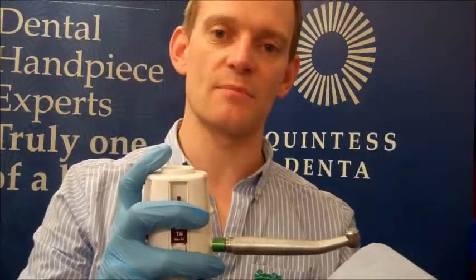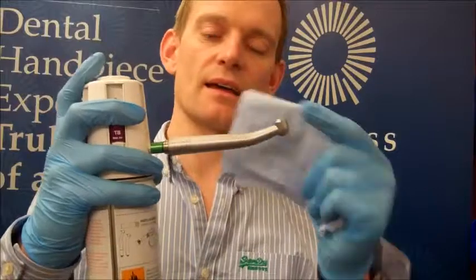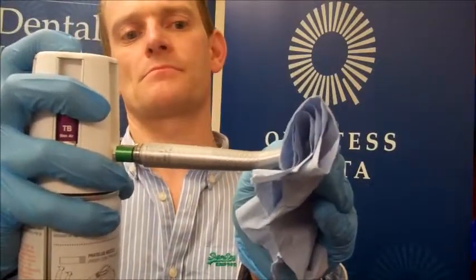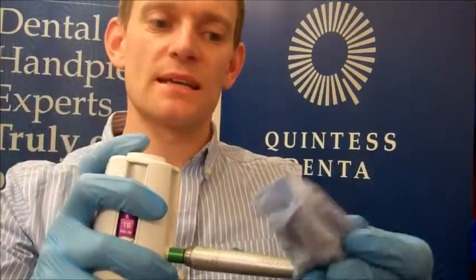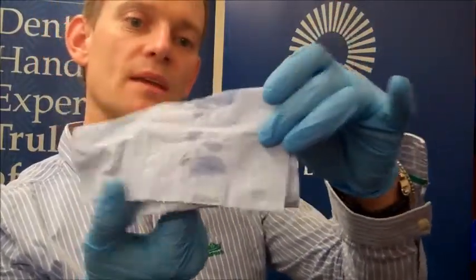I know it seems a long time, but it's very important that we get a build-up of pressure inside the head, which will turn the cartridge inside there and again break down as much dirt and debris as possible. So hopefully you'll be able to see the spray coming out of the back cap. And you should also be able to hear the impeller turning inside the head. Now, we want to see clean oil on the tissue paper. If it's not clean, you need to repeat that process, because that's the dirt being removed along with the oil.